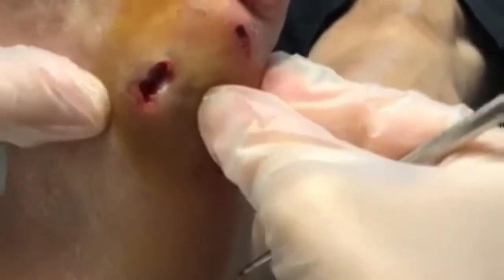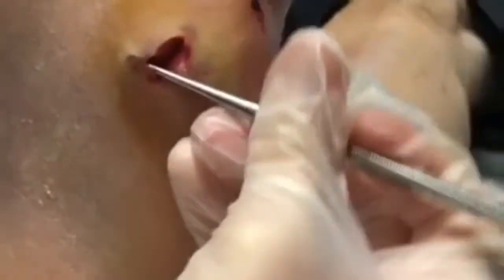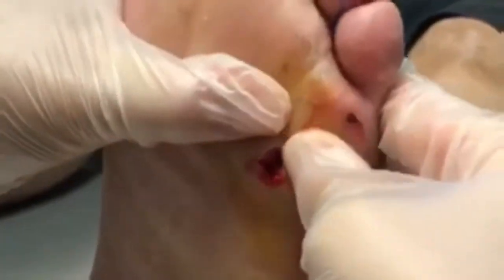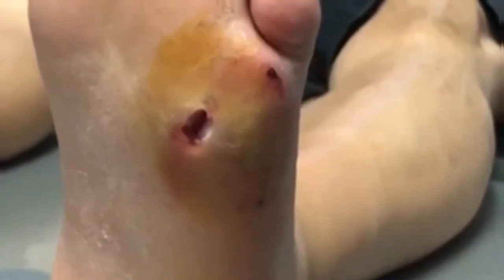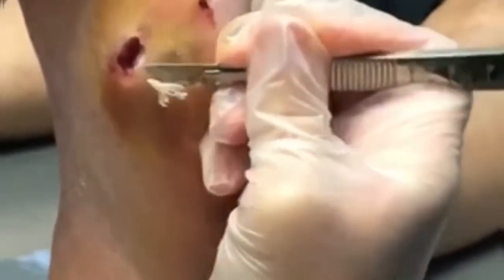It looks discolored over here, so I'm concerned about a secondary pocket over there. It doesn't appear to connect to this one, so I will check it and just make sure. Okay, nothing else in there. So this one looks really, really good. And it doesn't seem to really go anywhere, so that's a good thing. I'm gonna shave down over here and just make sure. Oh, there's more. It only poked you in one spot. I'm kind of shocked that those two places didn't communicate, but they didn't.